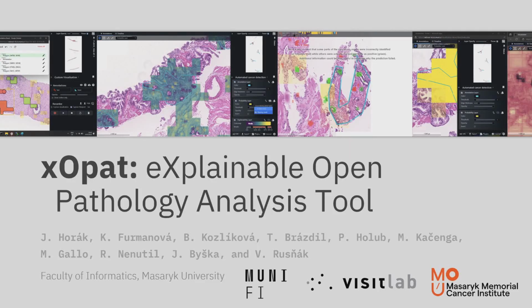Welcome to the talk about the xOpat viewer. We decided to create our own solution because existing ones are typically suffering from visualization and integrability issues discussed later. This viewer is actively used in machine learning research, publications, and software deployment, namely at Masaryk Memorial Cancer Institute.